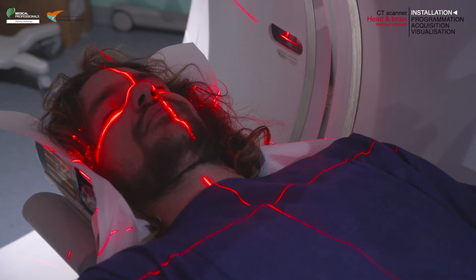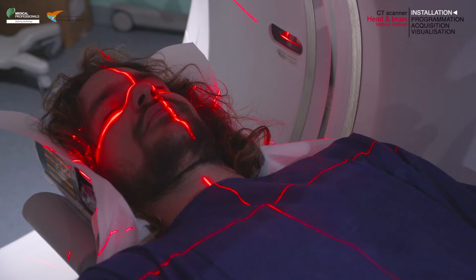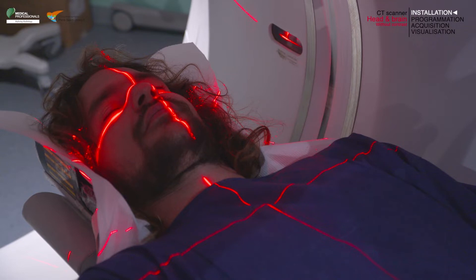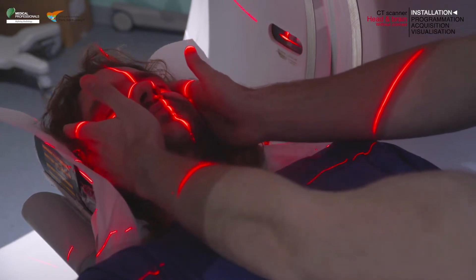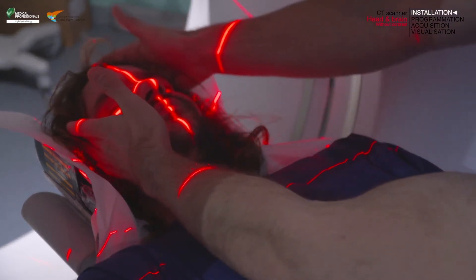Center the internal axial plane laser light on the appropriate landmark. Here we use the external auditory meatus, or EAM. Make sure that the lateral laser alignment light is at the mid thickness of the skull and that the longitudinal laser alignment light is placed on the median sagittal plane.